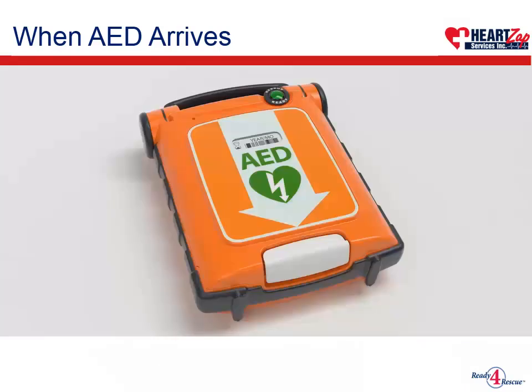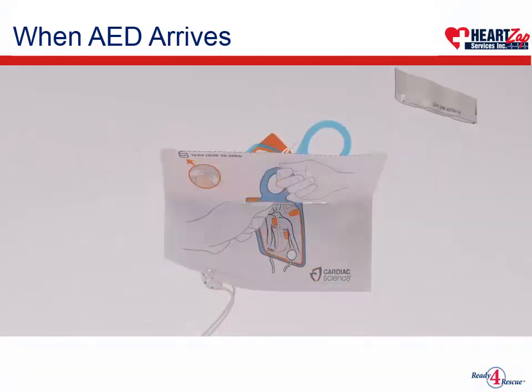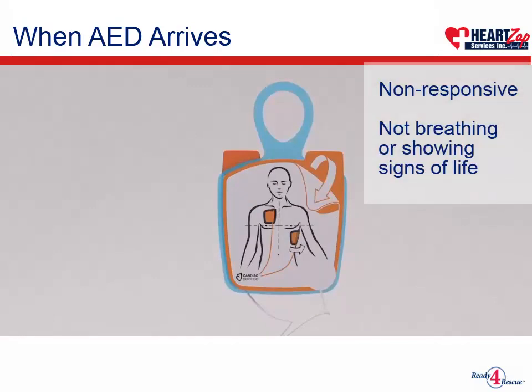Turn the AED on immediately by pressing down on the latch to open. Follow the AED prompts. Do not open the electrodes unless you have confirmed that the casualty is non-responsive and not breathing or showing signs of life.